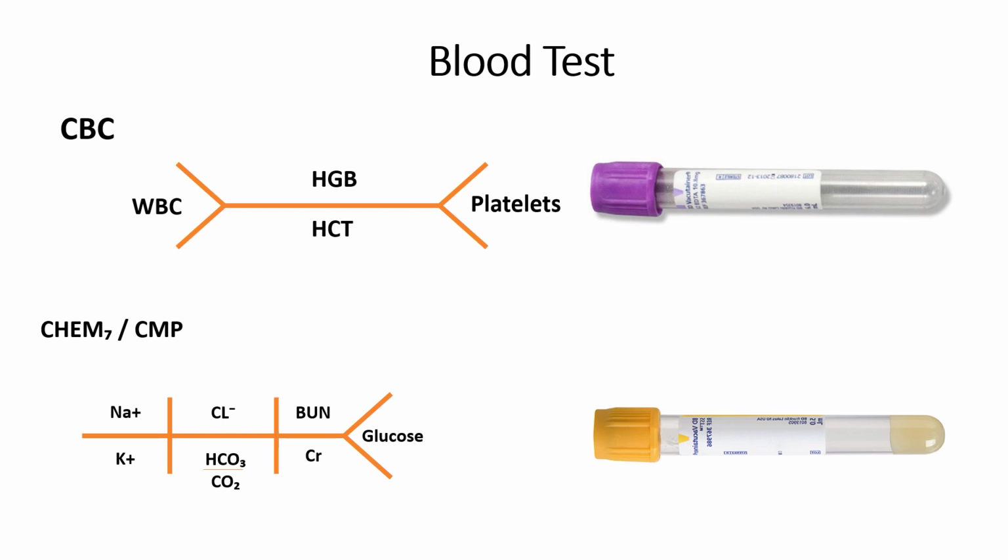So, por eso es que tenemos nosotros que estar mirando, chequeando los resultados continuamente para poder comparar y nosotros poder decir que sí, tenemos que actuar clínicamente, puesto que ya podemos comparar un examen o unos exámenes, niveles de exámenes previos, ¿ok? De lo mismo que estamos hablando.